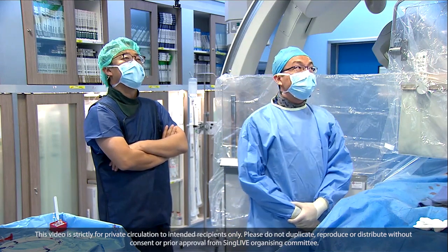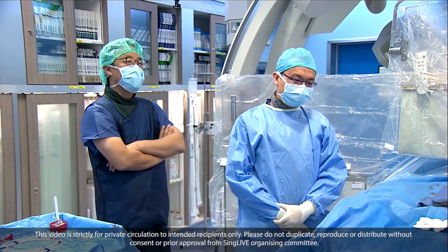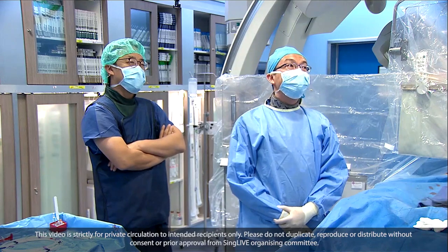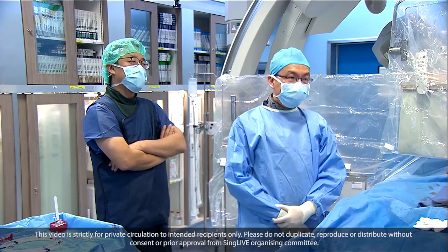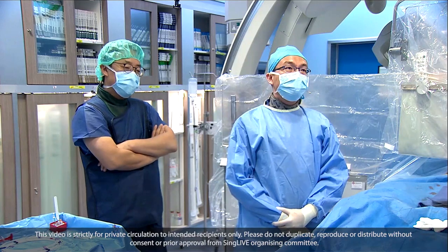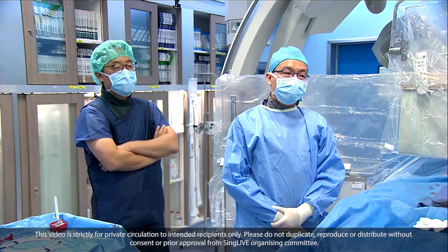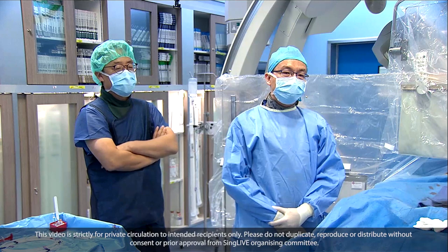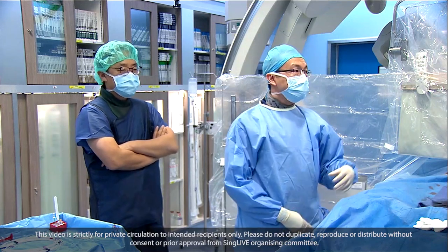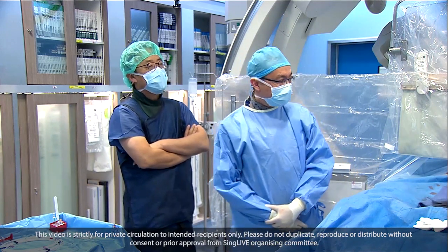Jumping in China, this is your daily case, right? It's complicated, the left main disease. So I try to treat this kind of left main disease as simple as possible. I would use IVUS to guide stenting, but in my routine work I wouldn't use IVUS very often. Just angiogram guidance for standard stenting. If I meet some problem, I would do IVUS and finish this case.